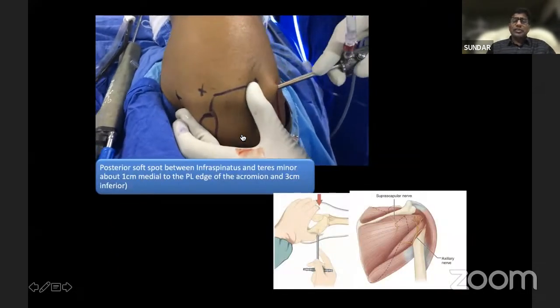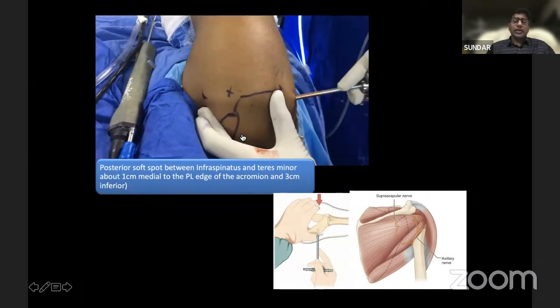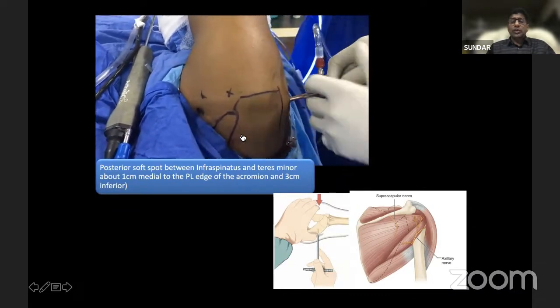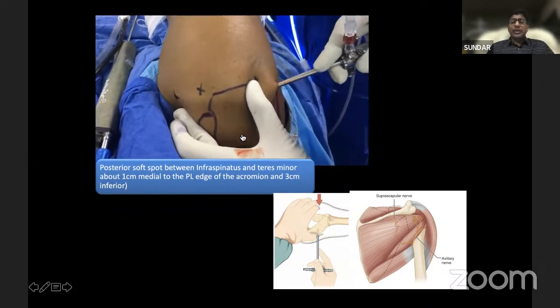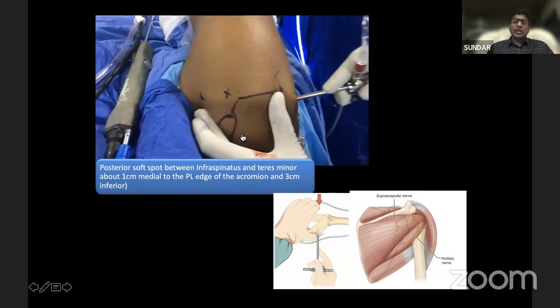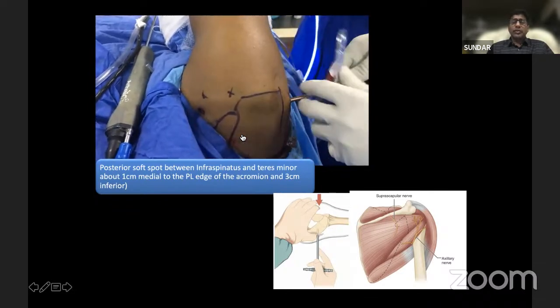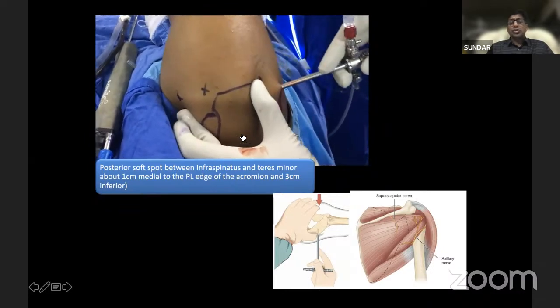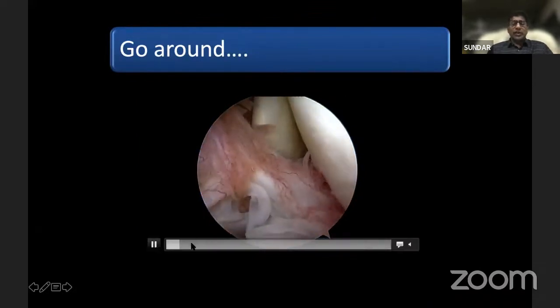Entering the joint is always tricky when you're a beginner. So make sure that you aim, you see that my index finger is on the coracoid. You insert your trocar, just feel the humeral head, then slowly insinuate your trocar between your glenoid and the humeral head. You will have a slight clack sound, and with a sudden giveaway, that means you are entering the joint. Often you can go under the acromion, so you have to be careful that you point slightly downwards and medial and towards the coracoid, then you can easily enter.